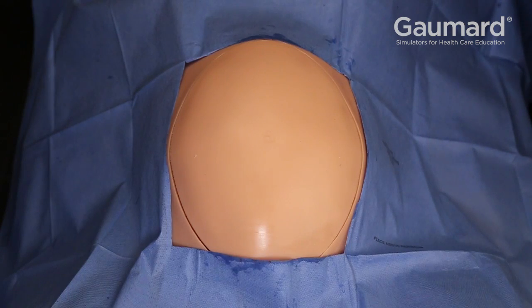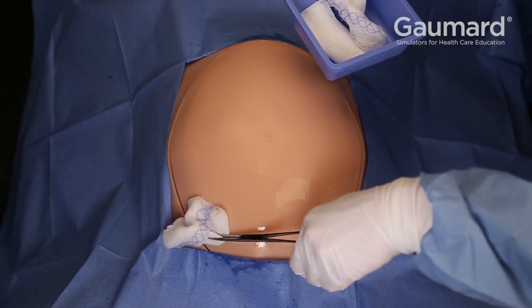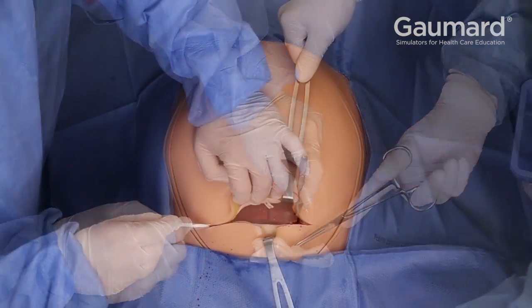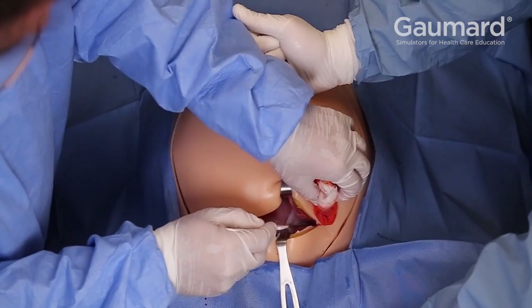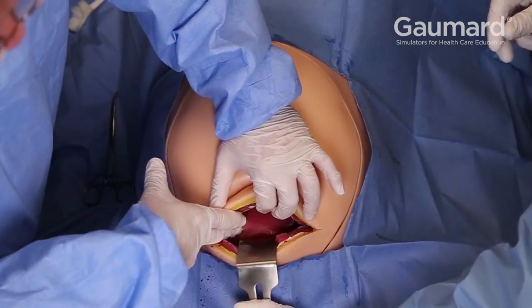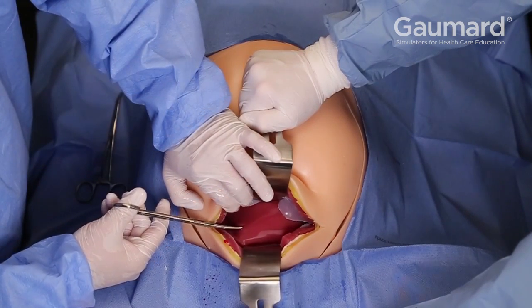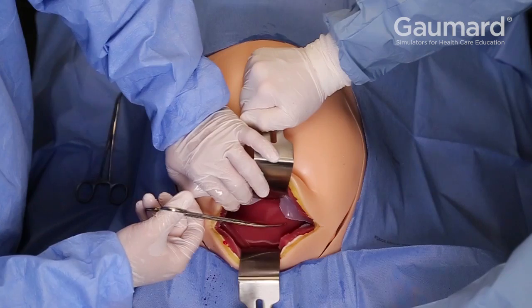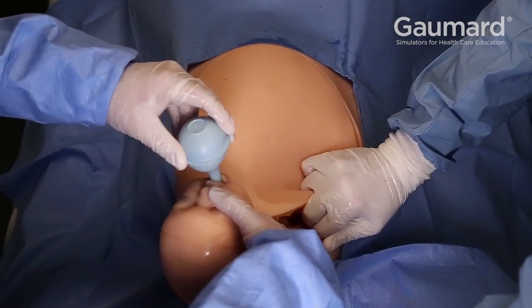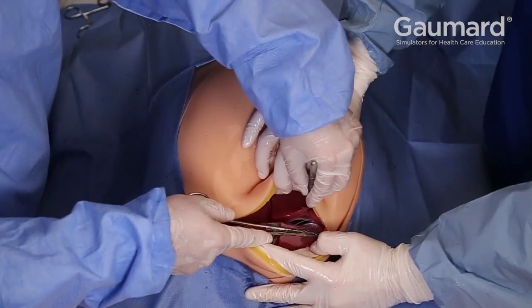Please note that hot tools are not supported with the c-section abdomen. The c-section abdomen and insert have realistic skin for use with real surgical tools for incisions, delivering, and sutures. The c-section insert has simulated blood between the layers for realistic bleeding and cleaning during the surgical delivery. Once the baby has been delivered, the umbilical cord can be clamped and cut, the placenta can be delivered, and the layers of the insert can be sutured or stapled.